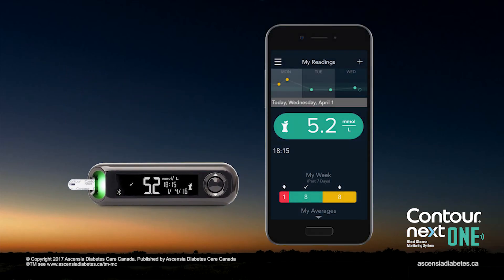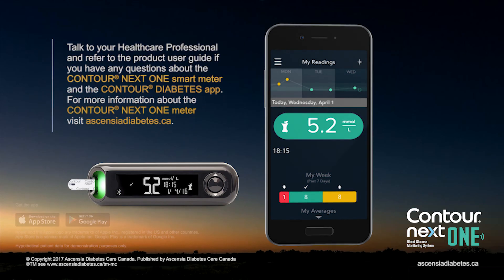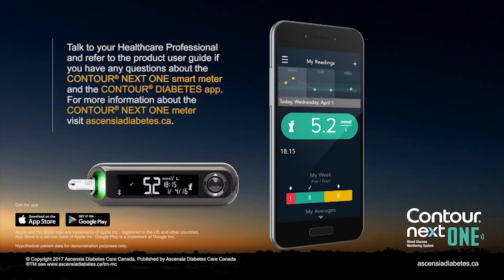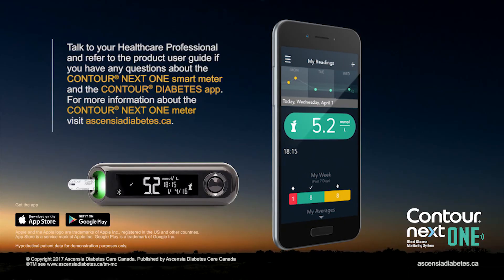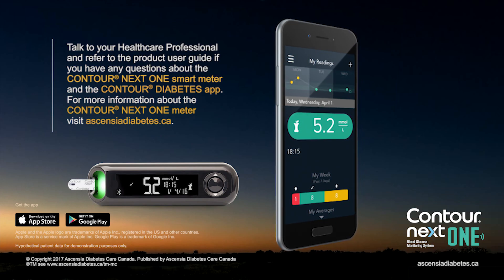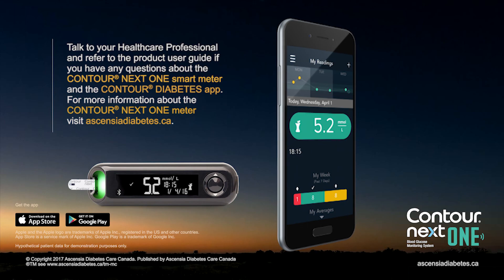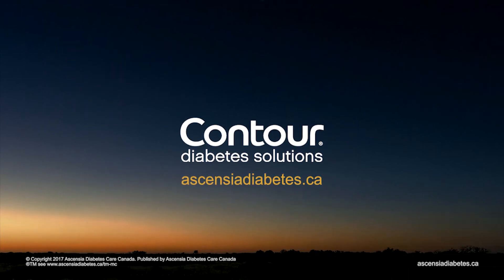The Contour Diabetes app displays your latest results on your mobile device along with information to help manage your diabetes. Talk to your health care professional and refer to the product user guide if you have questions about the Contour Next One smart meter and the Contour Diabetes app. For more information about the Contour Next One meter, visit ascensiadiabetes.ca.